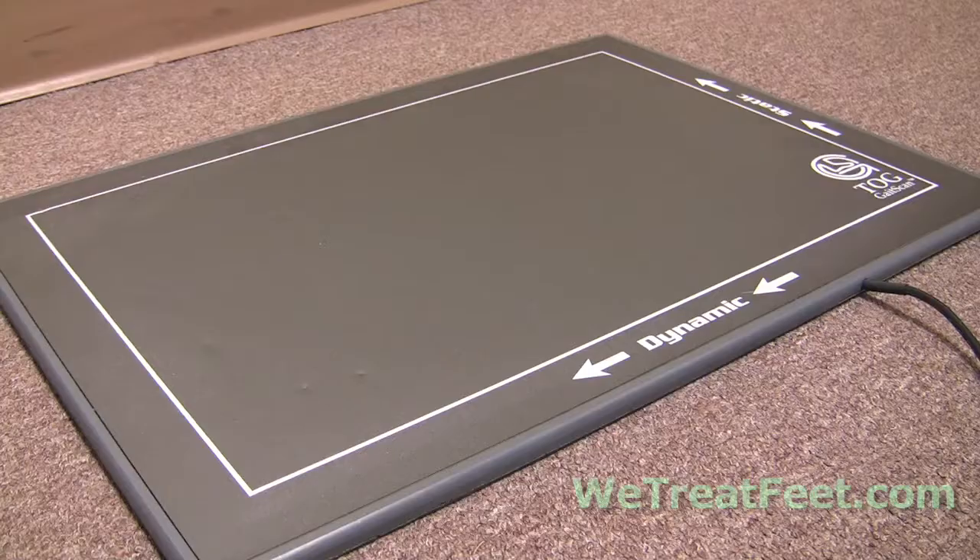I like to tell patients this is the easiest medical test that they will ever take in their life. They simply have to walk. They do not have any needles involved. There is no pain involved. There is no dye shot into their feet. They simply stand on what looks like a floor mat and then walk over that same mat. The computer records the pressures as they walk over the mat.